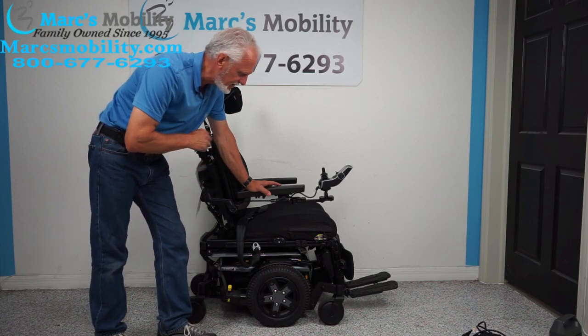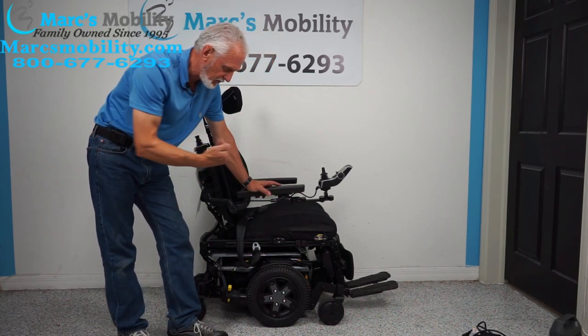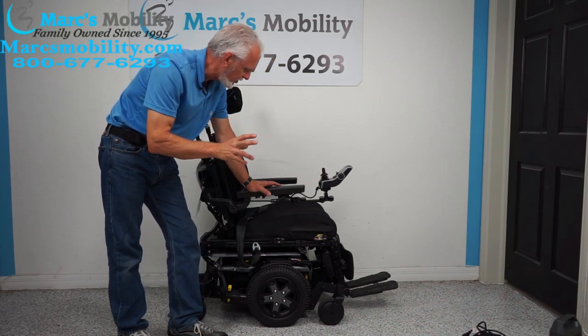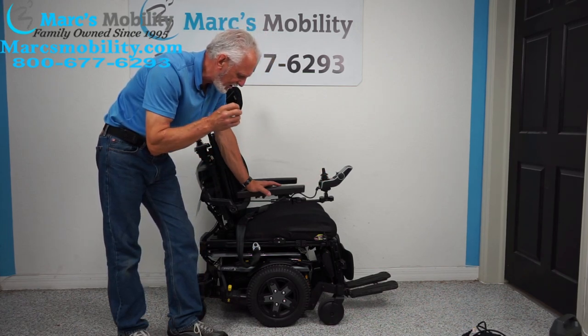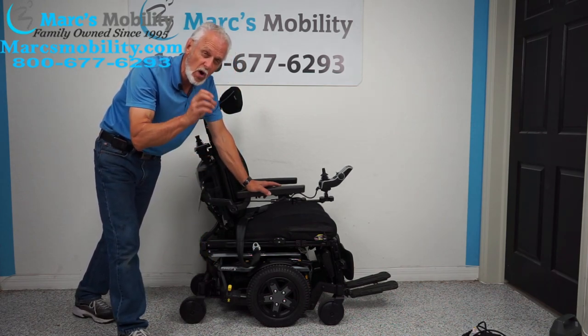It has 4 electrical functions: the 12-inch seat lift, the electric tilt, the electric recline, and the electric feet. It has other features which I'll cover as we go along. This is the Quantum Edge 3, the latest in technology from Pride Mobility's Quantum department.